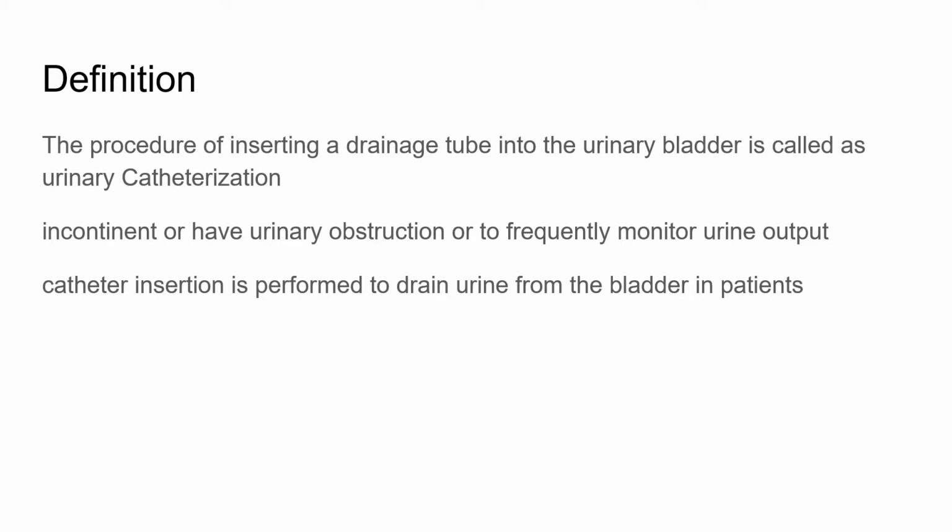And the third one is to frequently monitor the urine output as a proxy for renal function. If the patient is not giving proper output and the input and output cannot be maintained properly, in such a condition the input and output can be maintained by inserting a catheter and measuring how much urine has passed and how much fluid has been taken in. So this is a proxy for the renal function.